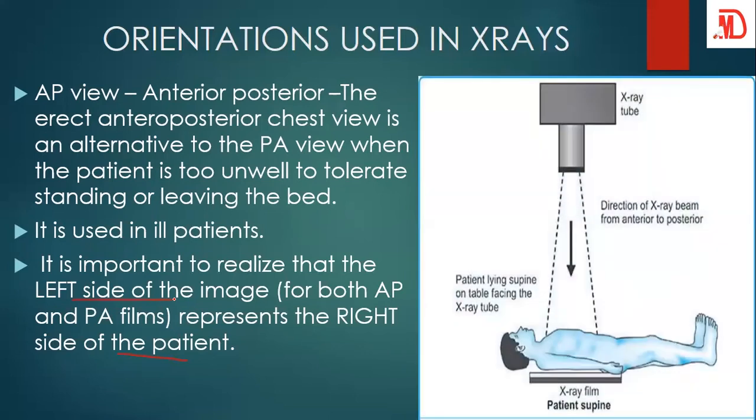So this is it. The patient cannot stand, so he's lying down there. We have put the film at his back, and then the source of radiation is just above him as he's lying supine.